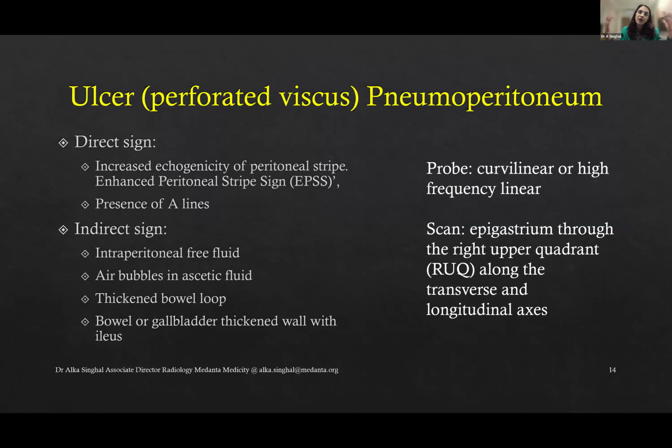So basically here we are trying to diagnose if there is free gas, free air in the peritoneum. Now, how do we sense that there is? Obviously, when there's a lot of free gas, the first thing you will see, when I put my transducer, is that I can't see anything. That just hits you.